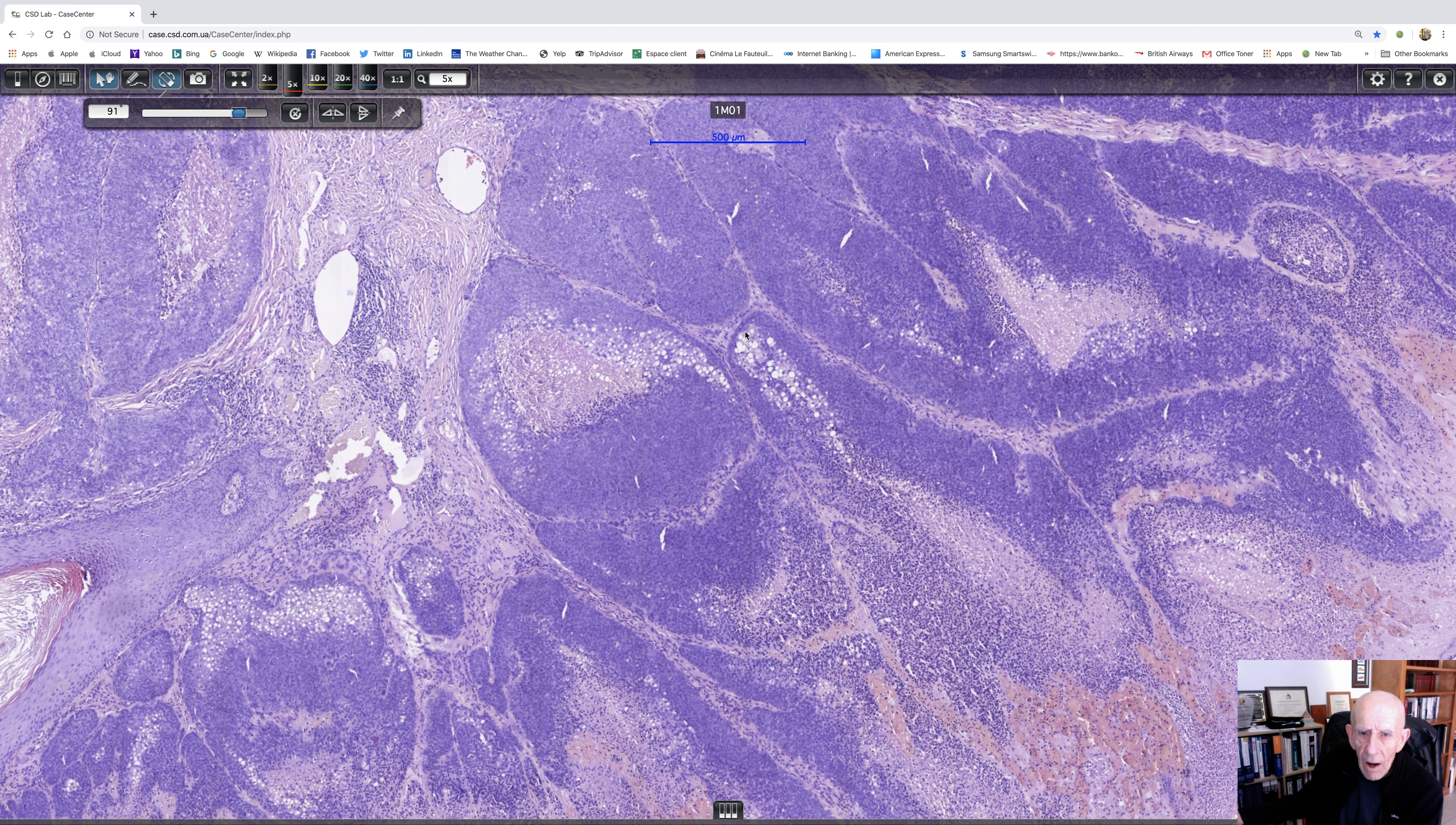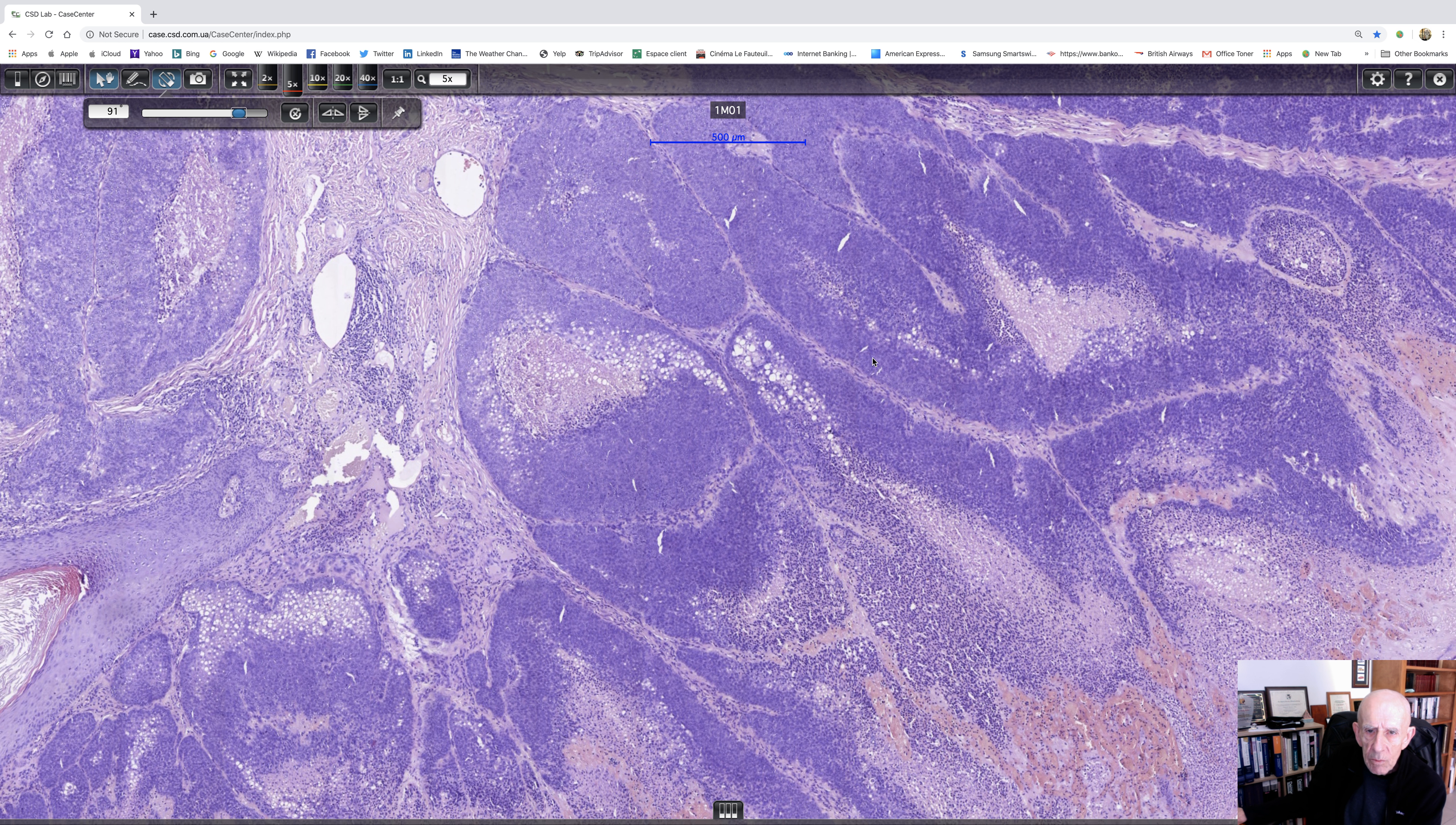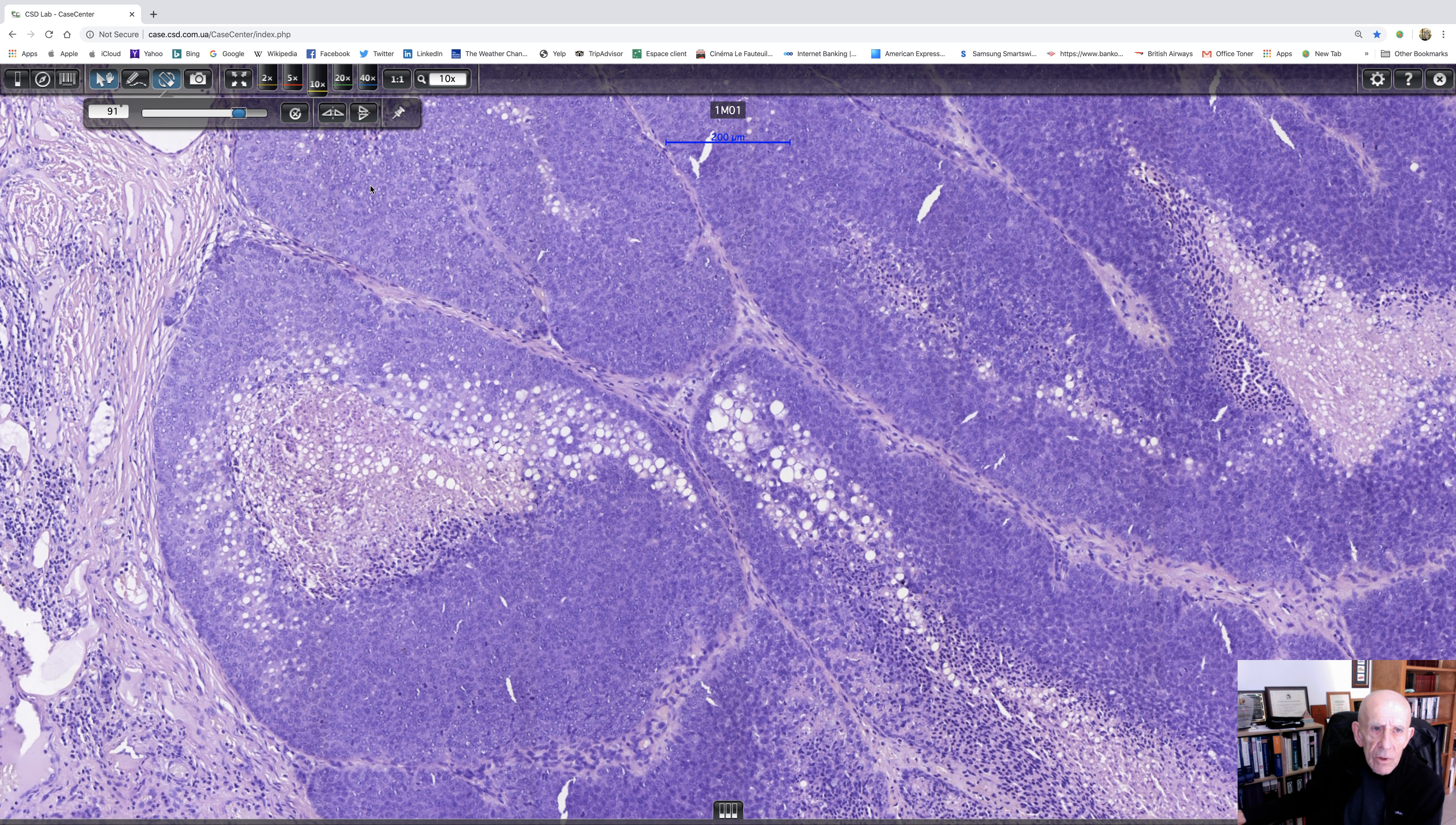And in fact, the two differentials that I would think of at this magnification are either a sebaceous carcinoma. I suppose it might be a porocarcinoma. And I suppose it could be a high-grade basaloid squamous carcinoma showing clear cell change. So those would be my three differential diagnoses. Let's see if looking at high power helps.